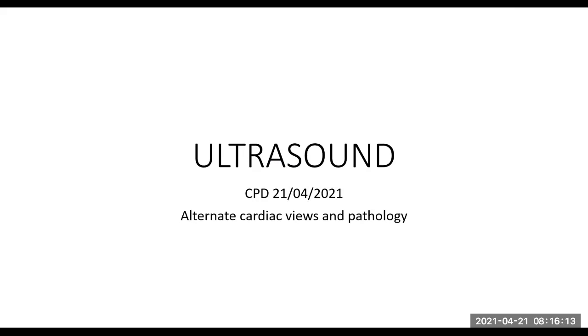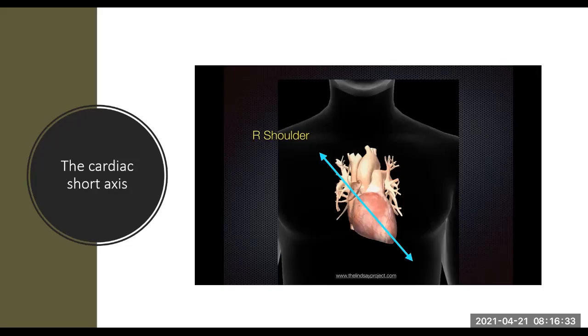And you guys were here when we videotaped Dr. Biela, and he was our model. We're going to go through a whole little echo just to show you some of the pitfalls and what you can see, what you can't see, and how it can be done on our machine, and that you can actually see the heart quite well. So that's why it's a bit long. We've got a few videos to watch, and then we're just going to concentrate on some pathology after that, right? So this is the first video that we're going to watch. It's the cardiac short axis, and let's see how it looks on this screen.